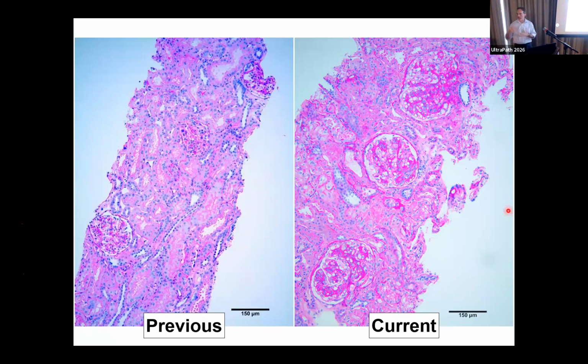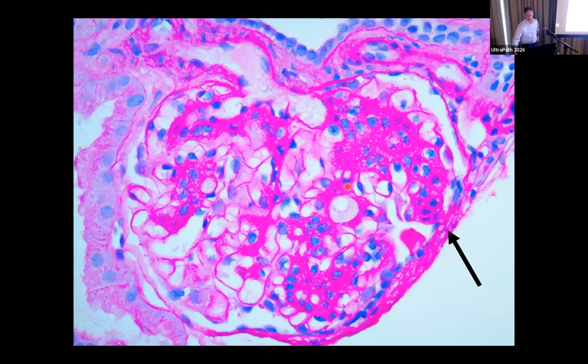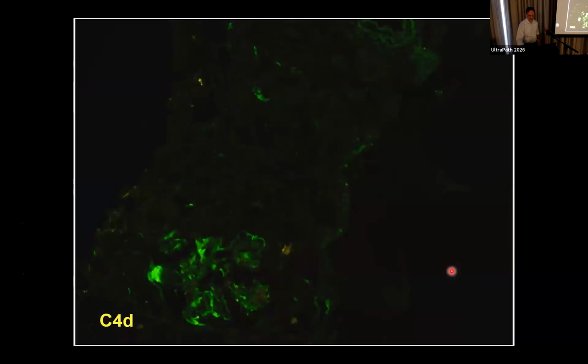There's glomerulomegaly, and there's enlargement of the glomeruli up to about 300 microns. And you can see this illustrated here. There's mesangial expansion, sort of similar to what we saw before, just more of it, more hypercellularity. There's segmental sclerosis that appeared, this sort of variegated mesangial expansion and hypercellularity that I talked about, and these foam cells. And you can see this illustrated with a silver stain.